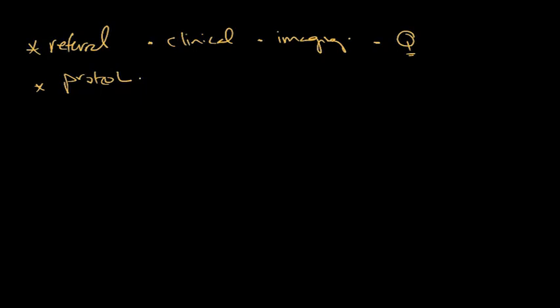It gives you a rough estimate how long this scan will take, because this is very important when you plan a clinical service and you want to know how many patients you can fit in your working hours. Also, you will need some basic information about the patient, like is your patient very frail? Is your patient able to do breath holding? Is the patient able to follow instruction? All this helps you to plan the right protocol to answer the question required.